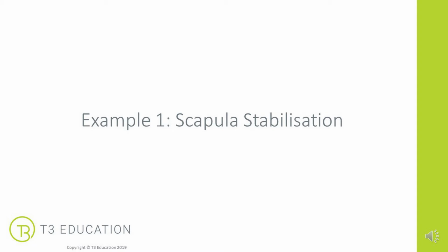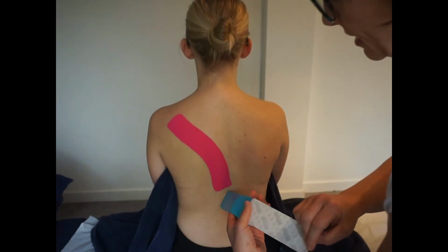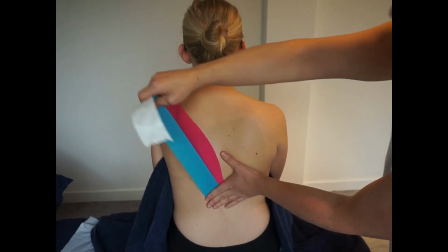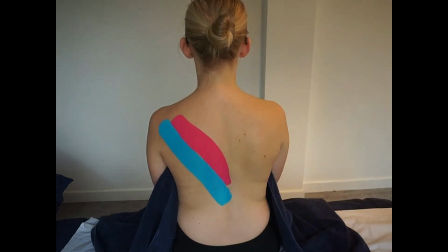Here is the simplest of examples. It's stabilizing a winged scapula, so creating a recoil on that bottom corner of the scapula into a more neutral, not winged position. So I'm going to anchor a good 3-4 inches of tape around that lumbar junction. Then I'm going to pull back onto a medium tension, the active part of the tape. Now I'm going to ask my client to stretch that scapula away, and I'm going to lay that tape down across the bottom corner and onto the back of the scapula, and then simply anchor with no tension. So this is creating that constant, quite strong pull on the scapula back into a neutral position.